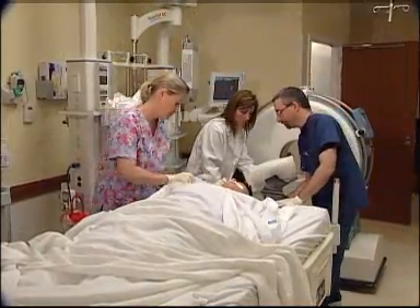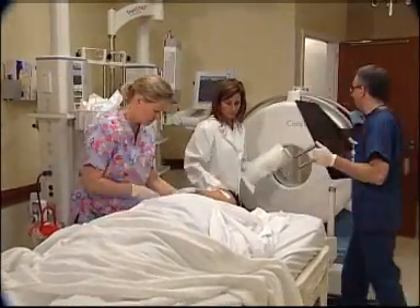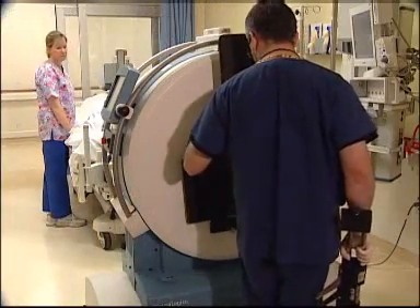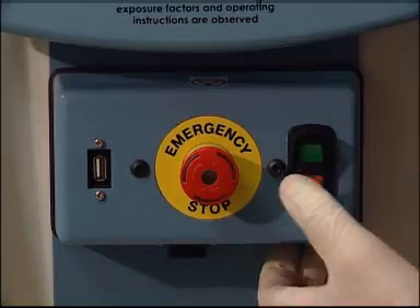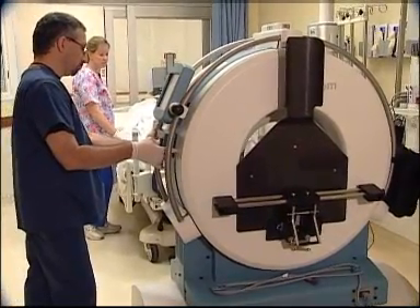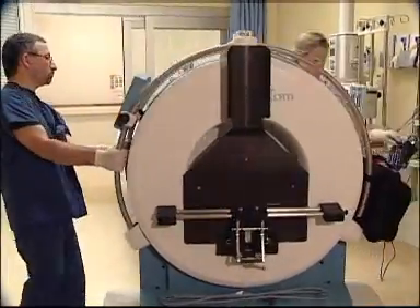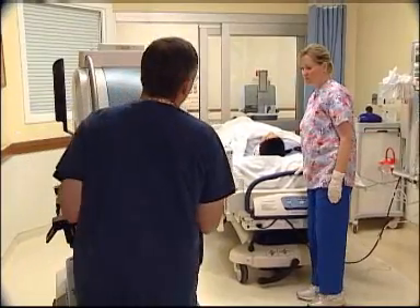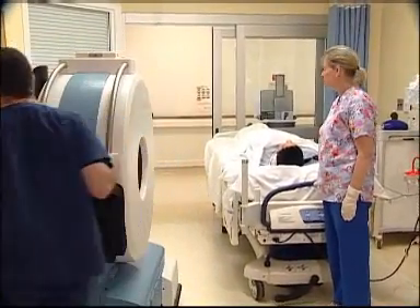Remove the scan board and mounting adapter from the patient's bed. Return these items to the storage slot and pegs located on the back of the scanner. Raise the scanner using the lift button on the side of the scanner. Remove the scanner from the patient's room. Return the scanner and workstation to the storage location. Plug the Ceratom in to charge when not in use.